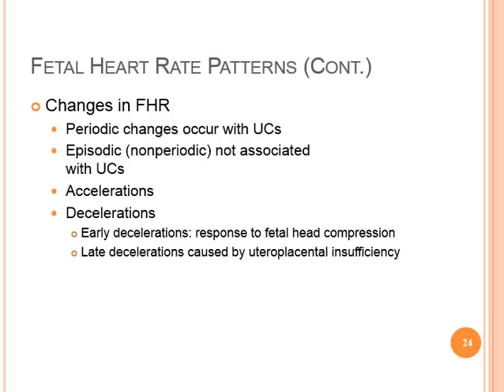Your accelerations can be either periodic or episodic. They may occur in association with fetal movement, or they can happen spontaneously. If accelerations do not occur spontaneously, they can be elicited by fetal scalp or vibroacoustic stimulation. And we know that accelerations are considered normal, and it means that I have a happy baby in utero.